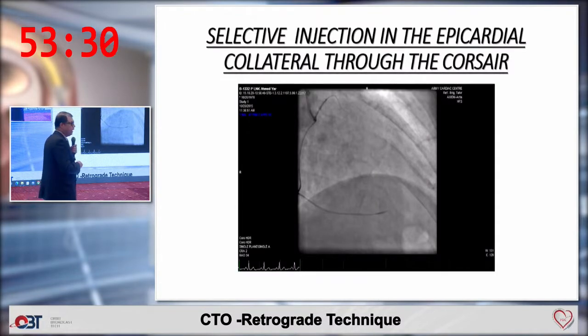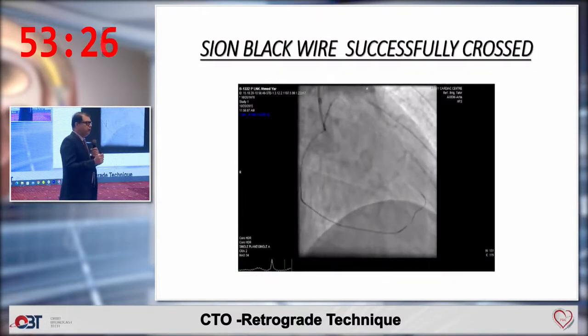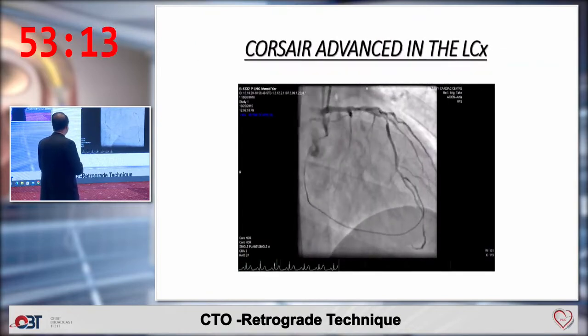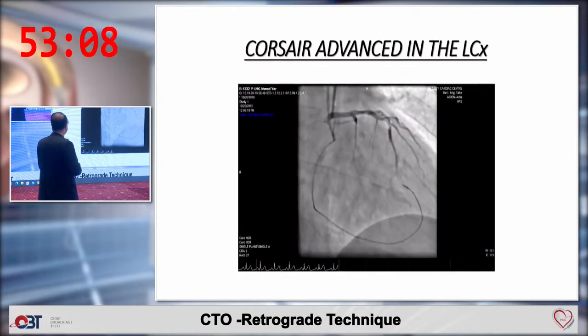So this is a Sion Black. Sion Black is basically a soft-tipped wire. It has a hydrophilic coating with a polymer jacket, so its tip is very soft, less than 1 gram. So we crossed with the Sion Black and advanced the Corsair in the circumflex.